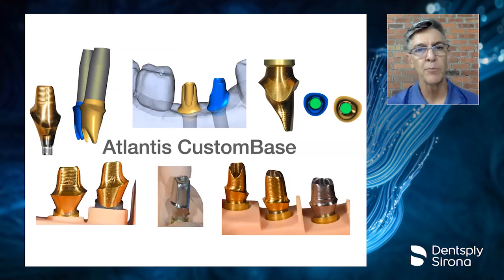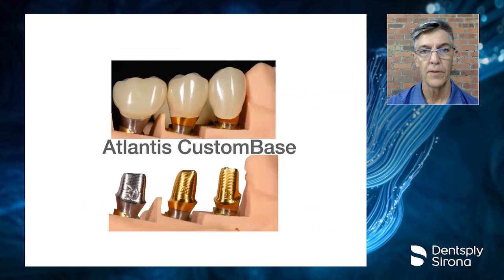So this is just an example of a few of the abutments that I've worked with through the last few years. I've had hundreds of these abutments made for me. And you'll note that everyone is different because everyone is completely custom for my particular patient's needs. Some margins are deep, some margins are short. The laboratory will have a good idea of where to place the margins to get the best aesthetic view, but also to have the most retention for the final restoration. And then at that point, crowns can be made.